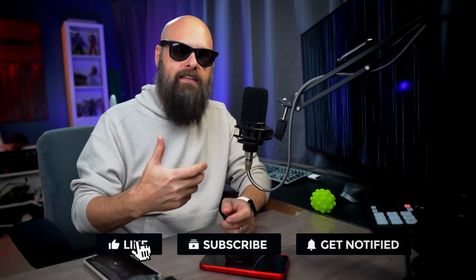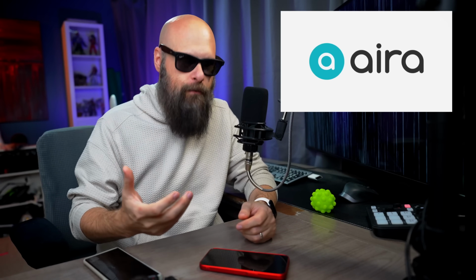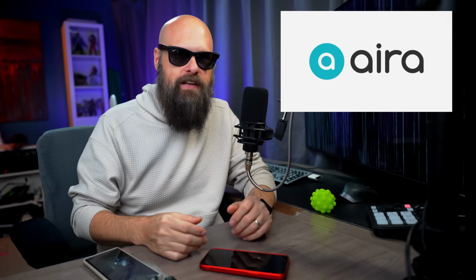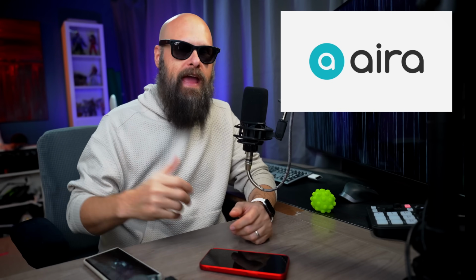So let's back up a bit here and explain what we're talking about. As long as humans have been able to use a smartphone to make a video call, the blind community has been using this to get help from their sighted supporters. So much so that businesses have sprung up around this idea. If you think of the very popular service, Aira, it connects you to an agent who has all of your information and can help with whatever you need. It's very popular. People use it all over the world, but it is a paid service.